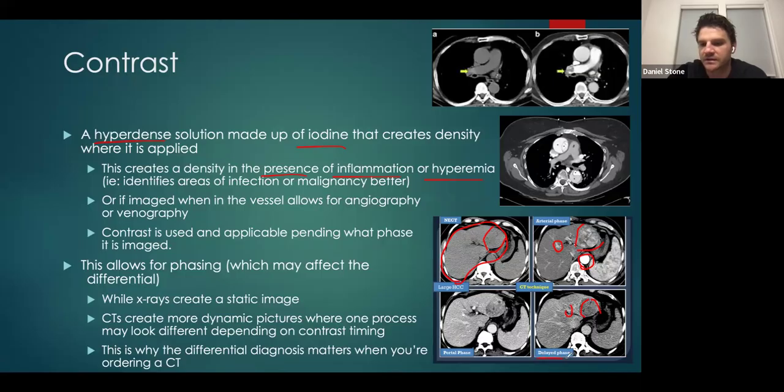When you delay the contrast, it might move away from more vascular structures because it moves through those areas very quickly. So in the top right, this is a very arterialized, hypervascular hepatocellular carcinoma, which implies that it's more aggressive.